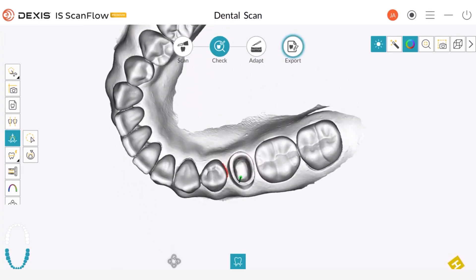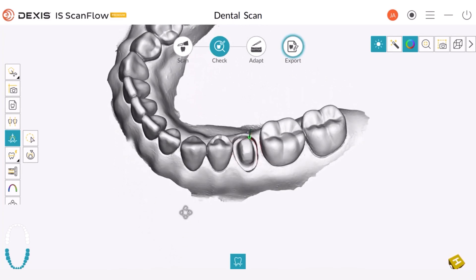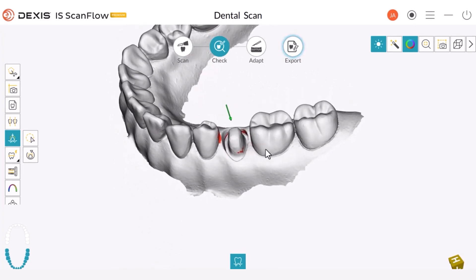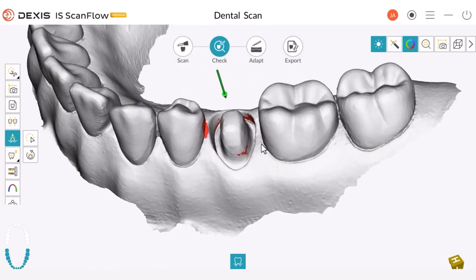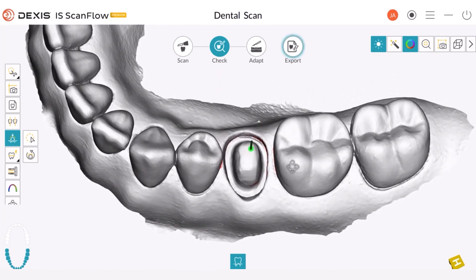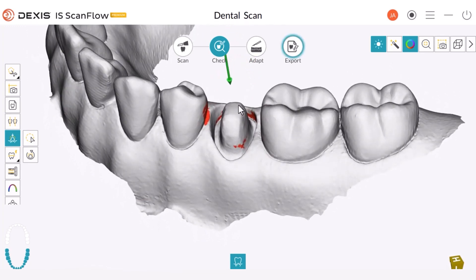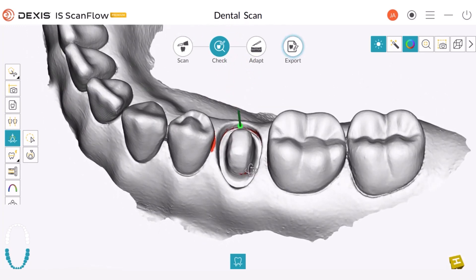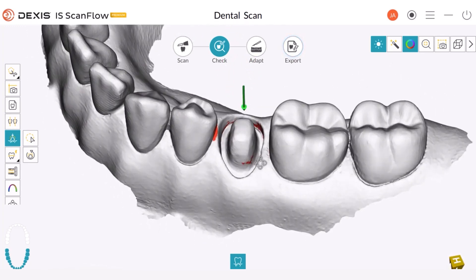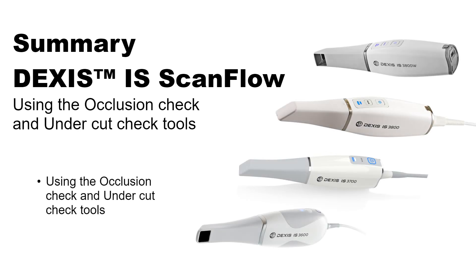We can use this option if we discover that the space is not enough or want to change it based on the measurement. At the end, we can disengage that option or take a snapshot if needed. This concludes the DEXUS IS ScanFlow using the Occlusion Check and Undercut Check tools recorded class.